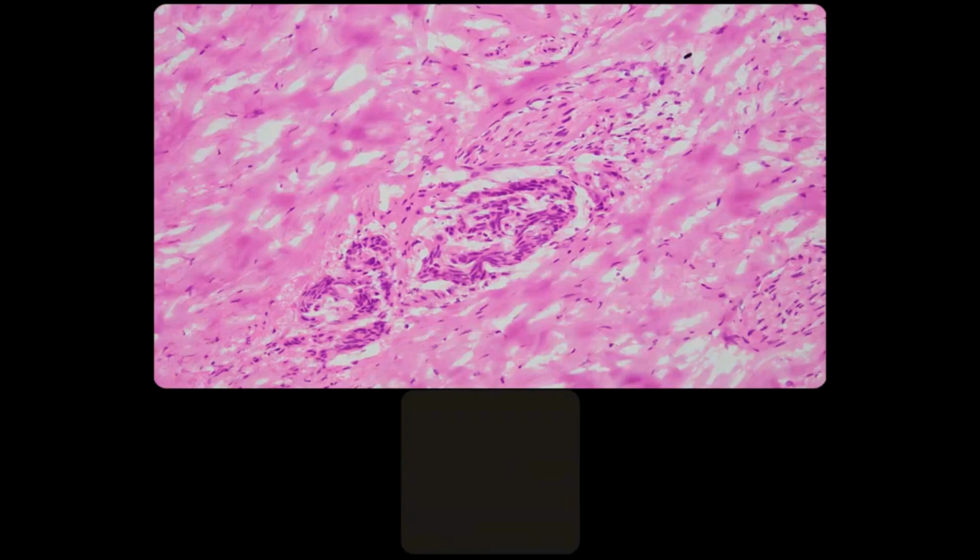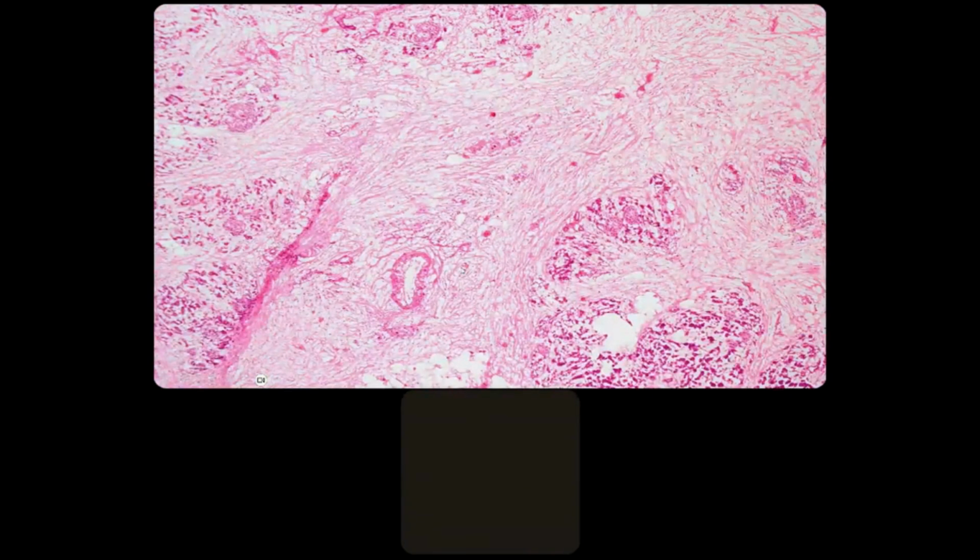Okay, here's an example of glands that are very close to a nerve. It's probably in another level was very in the perineural space. Again, if you look at architecture, you look at cytology, these are not normal glands. You've got single cells, in fact, a mitotic figure or two. And again, very much in keeping with adenocarcinoma.